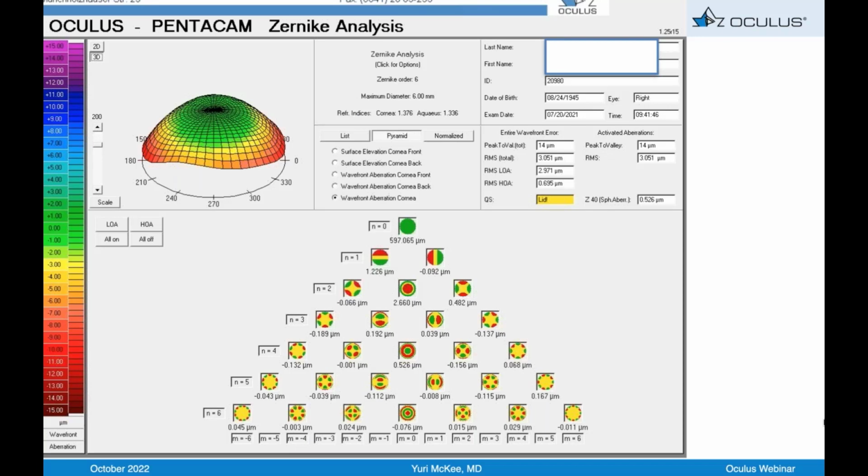And it's all a game of contrast when you're dealing with the combination of light refracting through the cornea and the lens. If you have a multifocal lens, which will by definition reduce contrast sensitivity because it's splitting light, and then you have spherical aberration above normal, which will reduce contrast sensitivity, the subtle combination of both of them may indeed cause poor visual quality. And this is why I tend to shy away from multifocal lenses in post-refractive corneas.